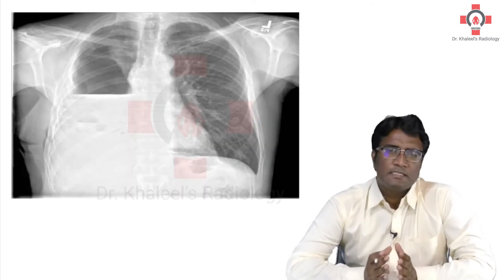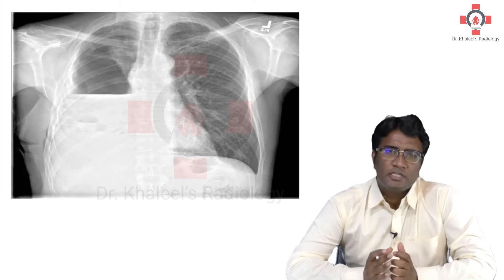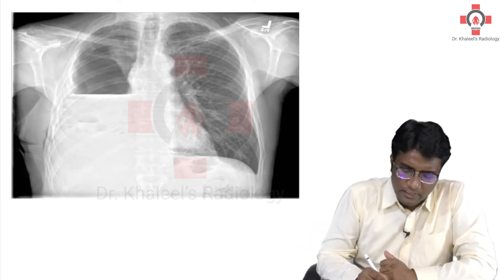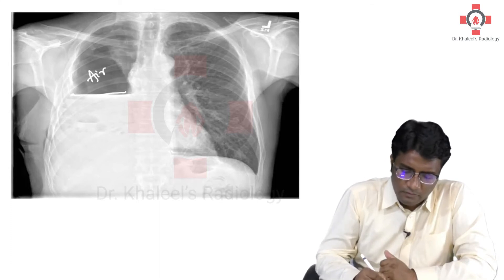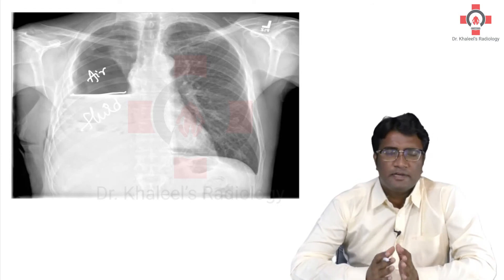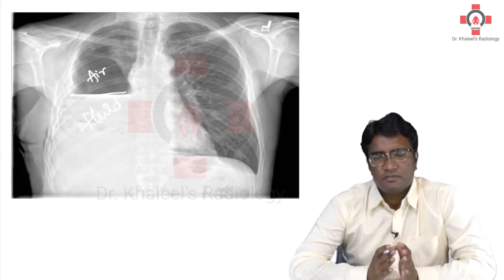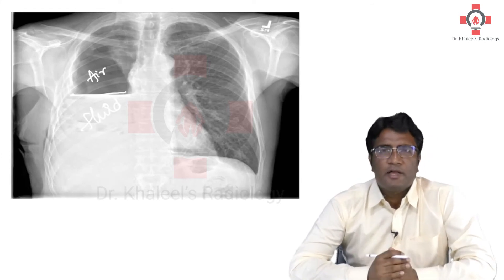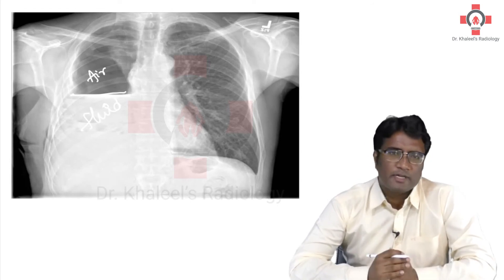Now, what do you think this chest X-ray finding is showing you? This chest X-ray finding is showing you a horizontal air-fluid level. This is the air and this is the fluid. You are seeing a horizontal air-fluid level in the right hemithorax. So this is hydropneumothorax.